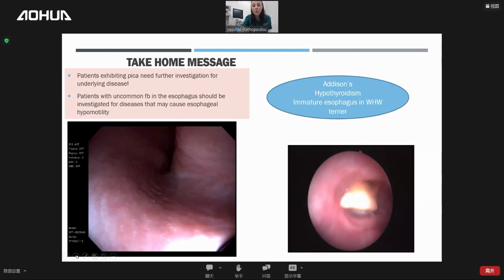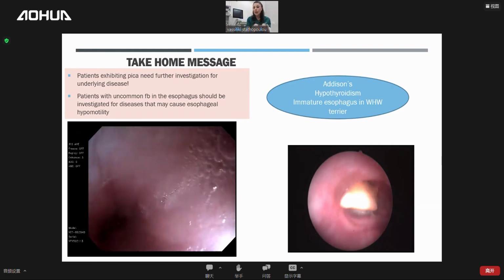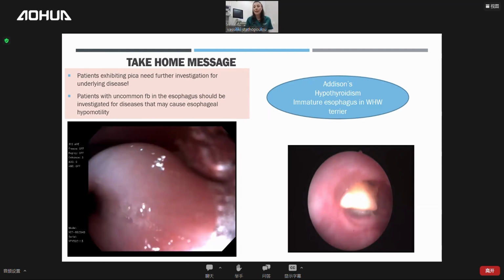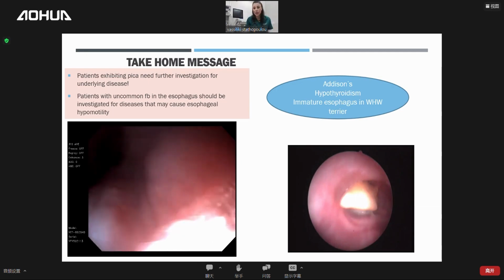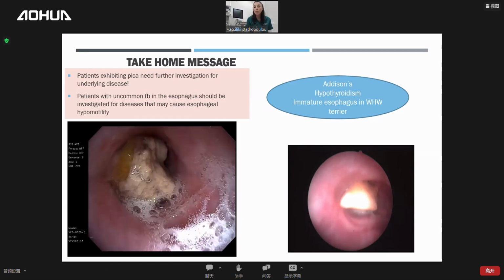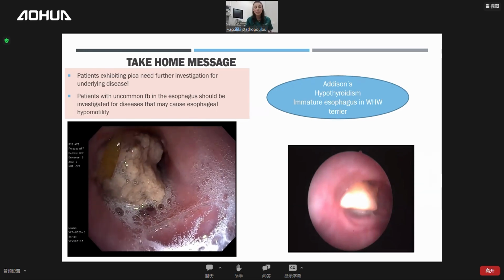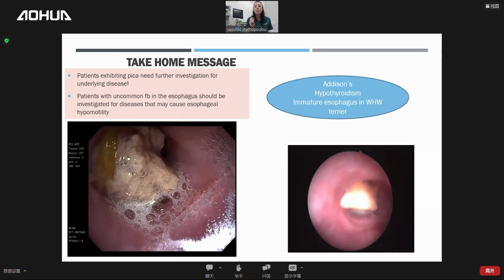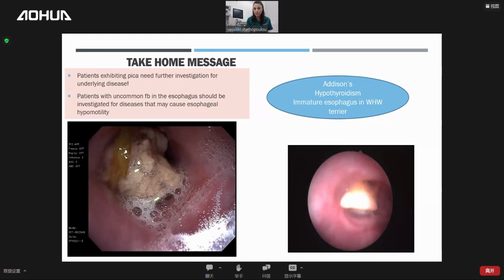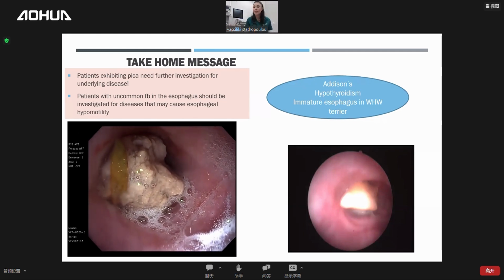And let's have a look at this one. This is actually soft food there. So you will be a hero when you just shove this foreign body in the stomach because it's food and it's going to be digested. But don't let this patient go home without a proper diagnostic procedure. This is, you know, very soft. When I saw that, I said, what is it? Is it a bone? Is it something hard? So we put in our forceps, as you will see, and it was very, very soft. It was dry food, and it was just there, lying in the esophagus for no reason.